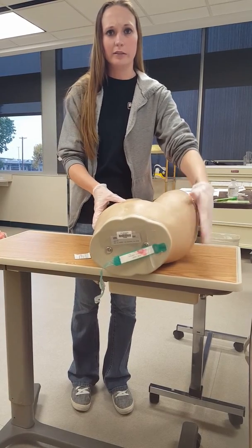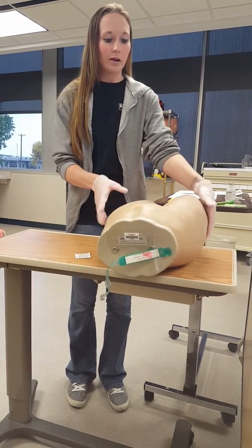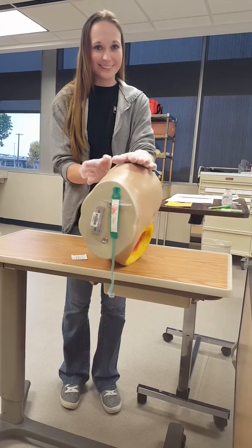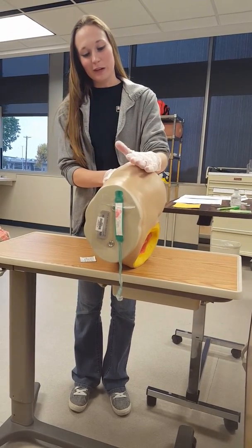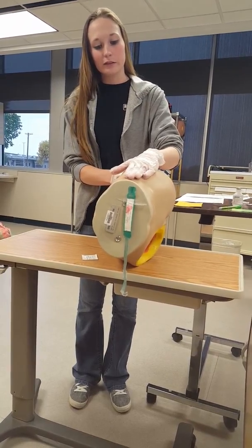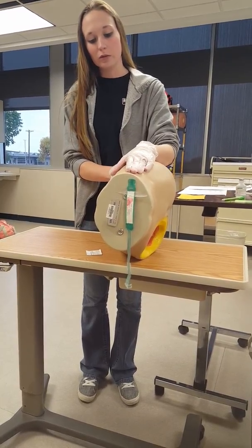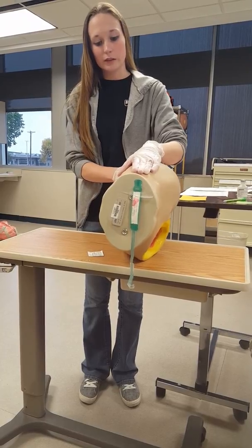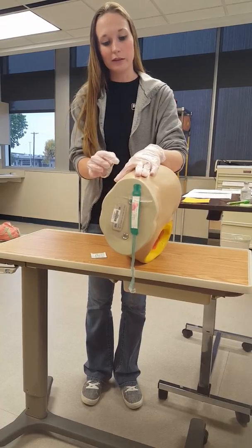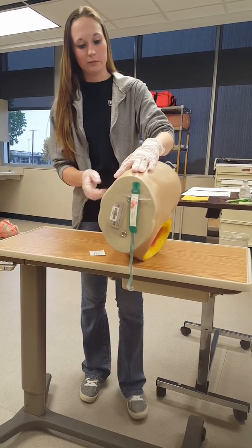Oh, is that the iliac crest and the spine? So okay, this is the gluteus. Sorry, I mixed that one up. So then I would find the hard part here, and I would have my fingers on where the iliac spine is, and this one would be going towards the iliac crest. And I'd move my finger like this, and then I would give it right in this area here on your iliac crest.